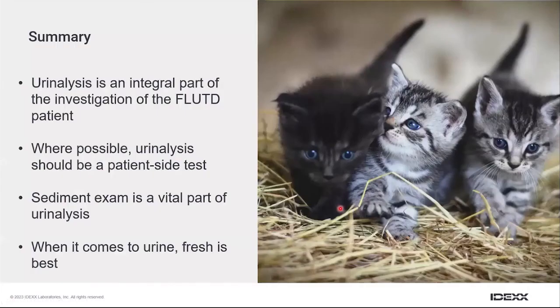So in summary, I hope from this presentation you'll agree that urinalysis is an integral part of the investigation of the FLUTD patient. Also, I hope you take home that where possible, urinalysis should be a patient-side test because of the risk of changes over time, which might affect your interpretation of the clinical picture. And even though sediment examination can be somewhat time-consuming, it really is a vital part of urinalysis to look for crystals, casts, epithelial cells, and also potentially things like bacteria. And most importantly, when it comes to urine, fresh is most definitely best.